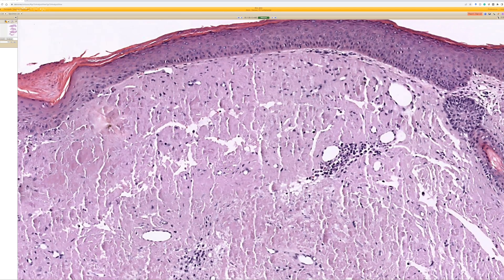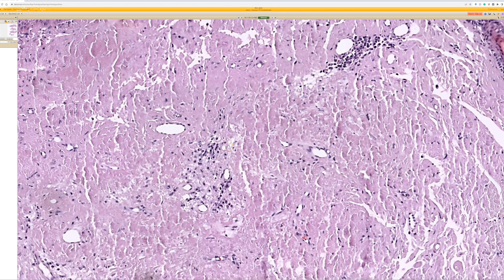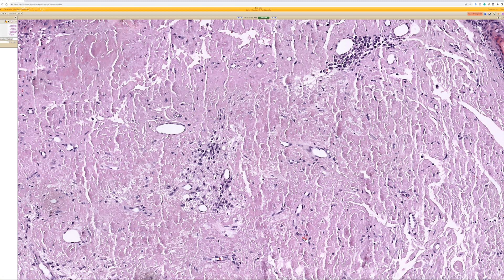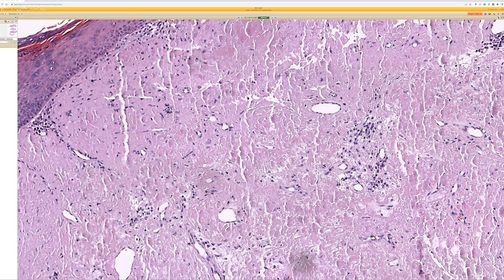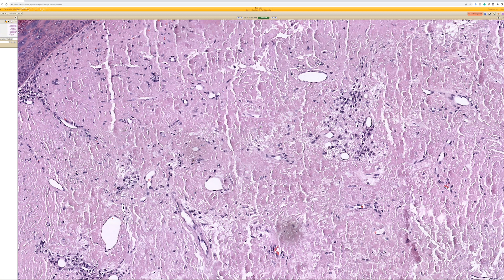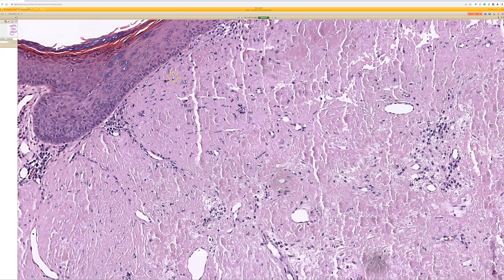Homogenized, amorphous pink material — sometimes there are other things that make amorphous pink deposits, and multiple people have asked me to make a video comparing all of them. I've put it off because it's challenging. Amyloid is actually a little easier to explain because you've got the nice cracking artifacts. Just like the keratin-derived amyloids, light chain-derived amyloid also makes cracks — the true amyloid seen in association with systemic amyloidosis.